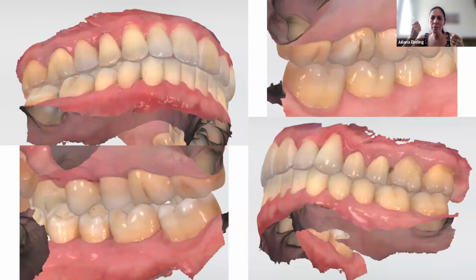It's all made by hand and with minimal adds of strategic resins, but we will adjust at the end of the process. I use OccluSense not only to check if I have a very high contact, but the final balance I will adjust at the end. And this is what we got.